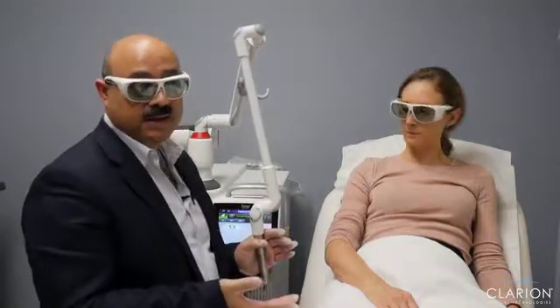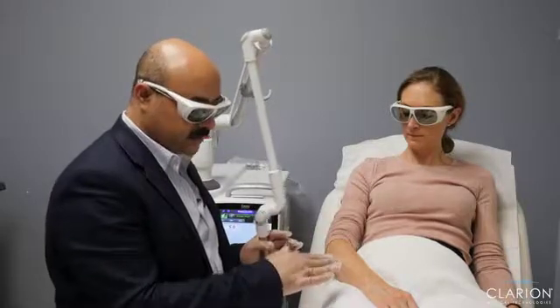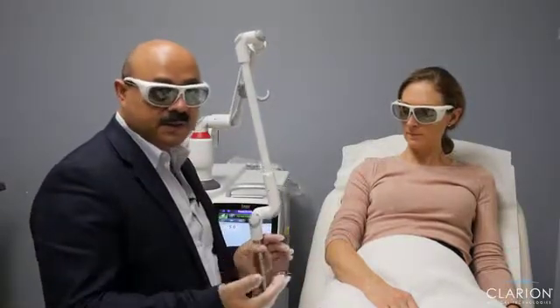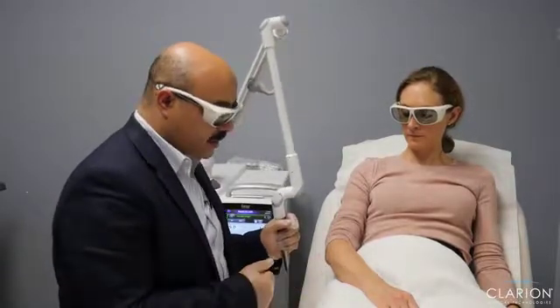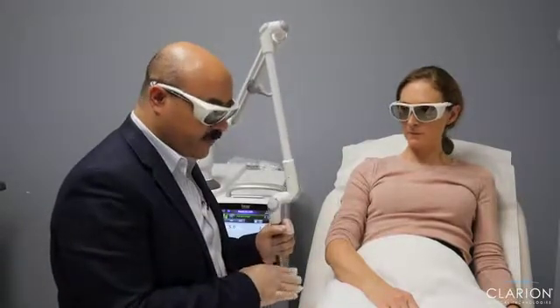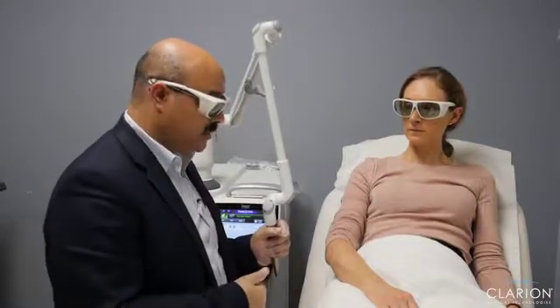It didn't require even anesthesia. I'm not using cooling, and we can see that it is an instant improvement of the skin. It will take maybe 3-4 days for healing, and I think it's a very simple procedure. Usually patients are very happy, and it doesn't require to be repeated once again.